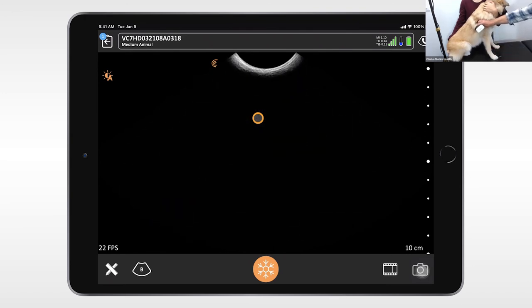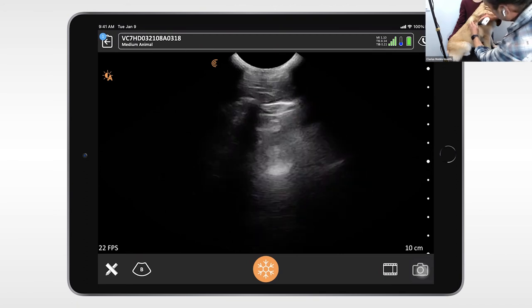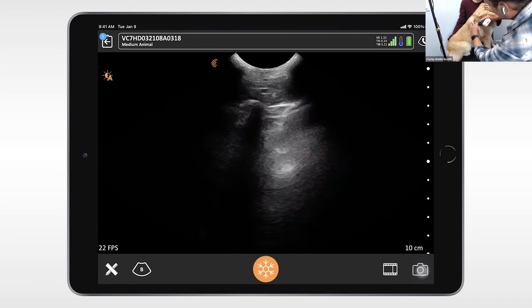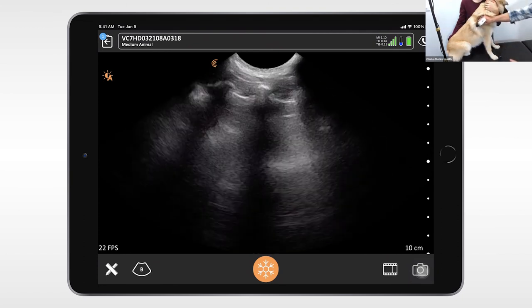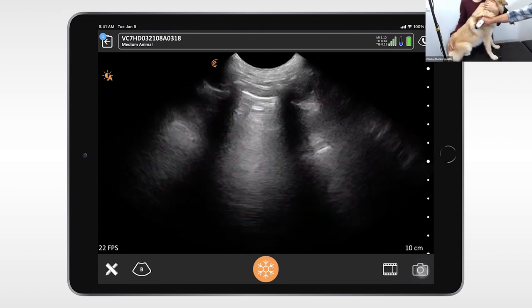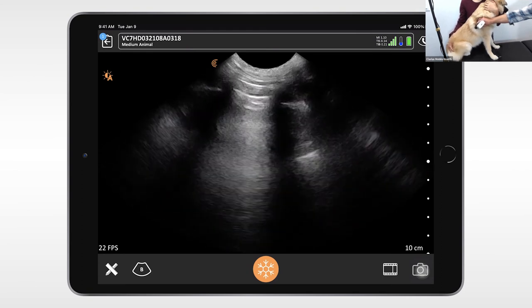And if you slide caudally, again, we've got a pretty thick hair coat, so you might have to pull the skin with you a little. Looks like it's hairy. This is the part from scanning humans I'm not used to, all the hair parting, but you've got to get down to the skin here. There we go. And then you just follow the scan down. Great. And you guys emphasized sliding in our last webinar, so that seems pretty straightforward.